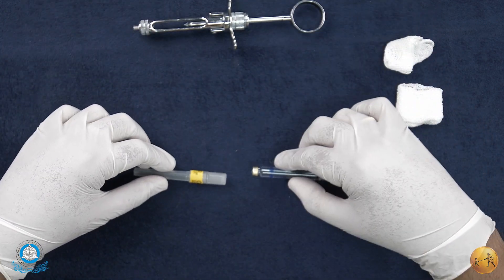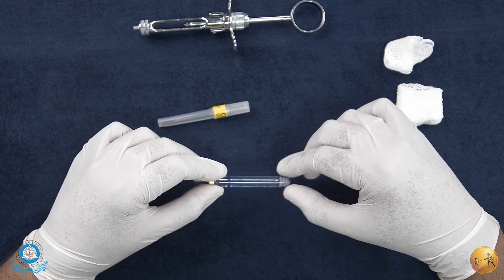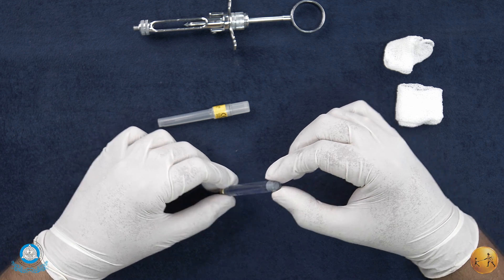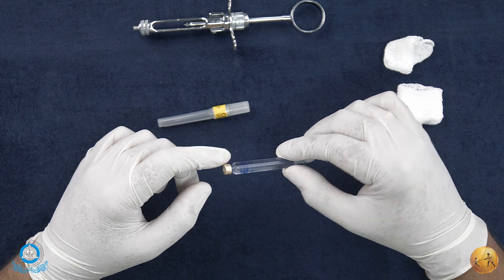Now moving on, we have the needle and the cartridge itself. We'll first talk about the cartridge. If you notice, this is a glass cartridge - it has a stopper and an aluminum cap with a diaphragm.